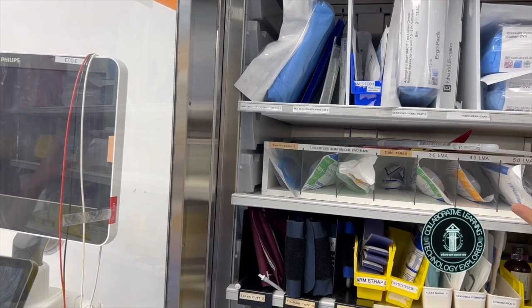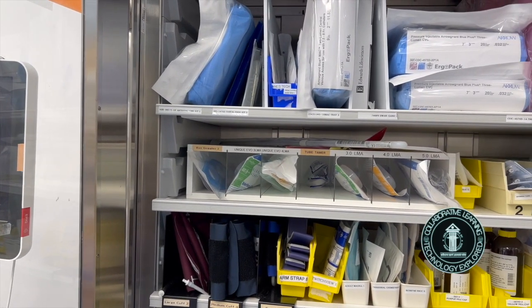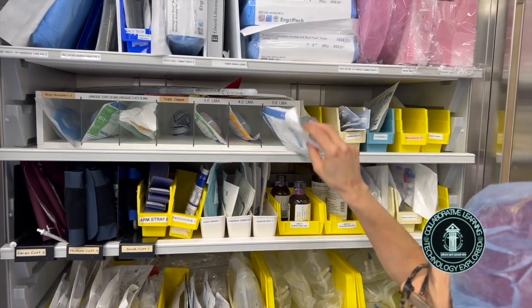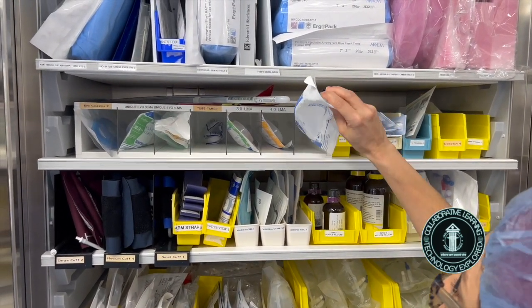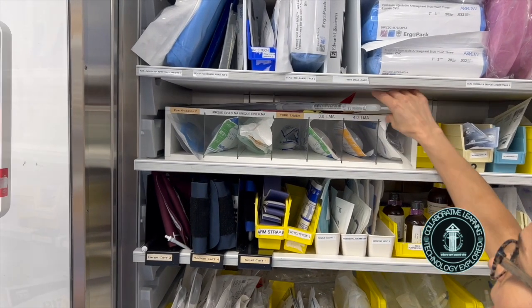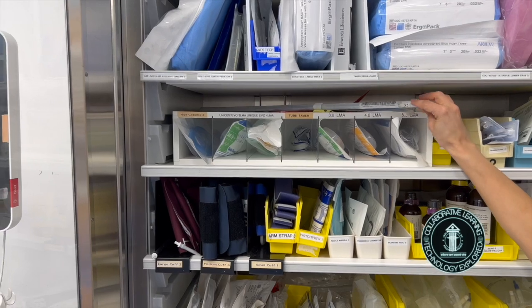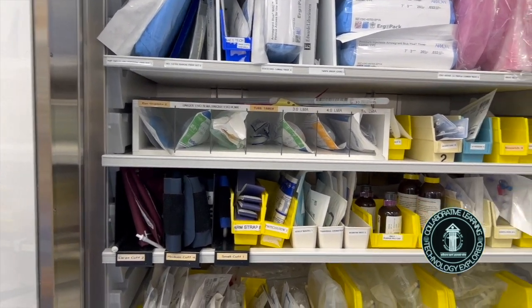We mentioned that all of the intubating supplies are in the lower drawers of the ventilator, but we have different sizes of LMAs and we have bougies available in case of a difficult airway. And that's additional to what's included in the difficult airway card that we will see soon.